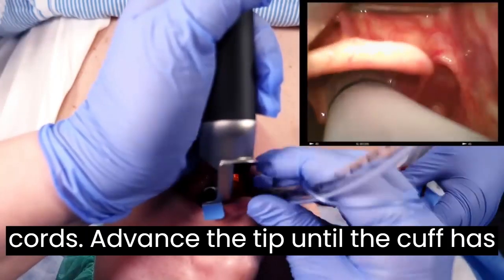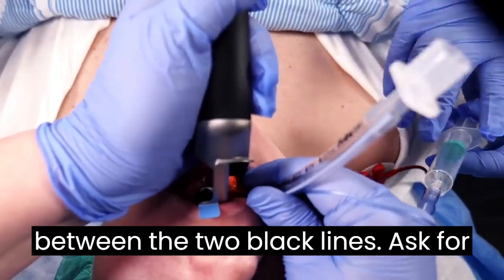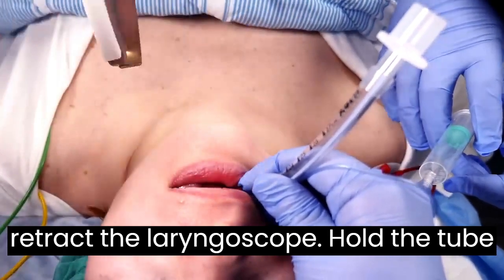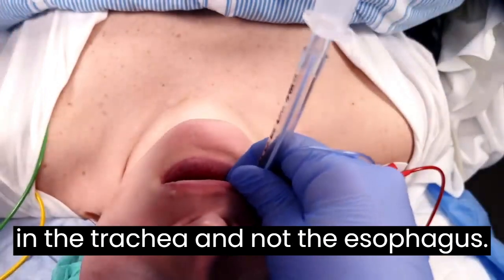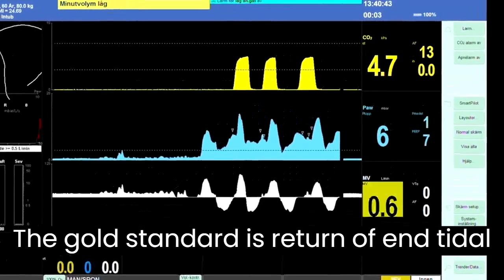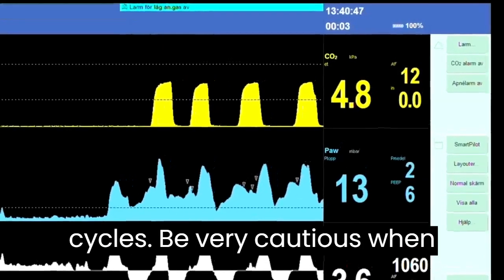Advance the tip until the cuff has disappeared and the vocal cords are between the two black lines. Ask for inflation of the cuff and carefully retract the laryngoscope. Hold the tube firmly while you confirm that it's lodged in the trachea and not the esophagus. The gold standard is return of end-tidal carbon dioxide over several respiratory cycles.